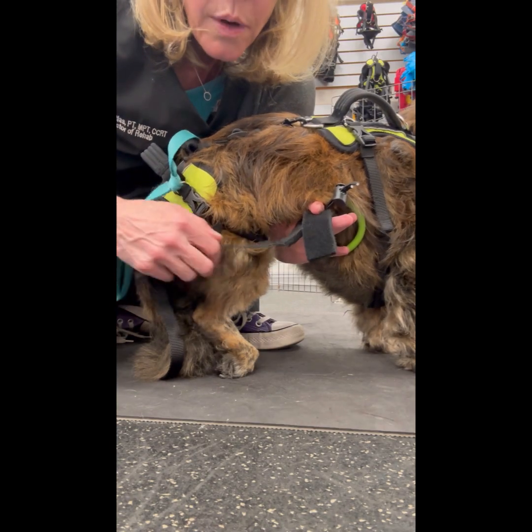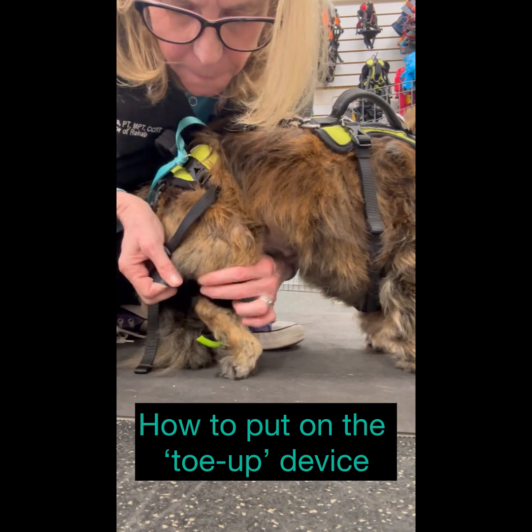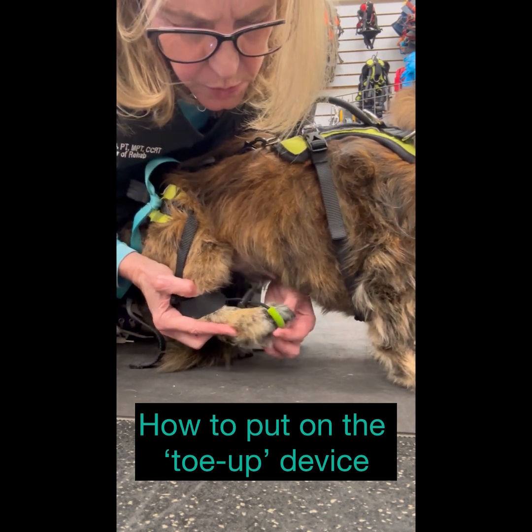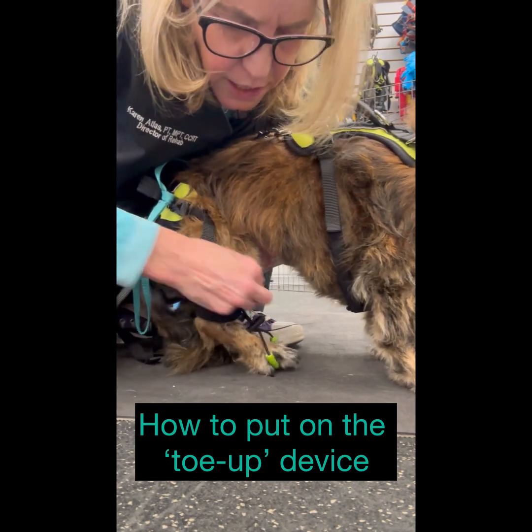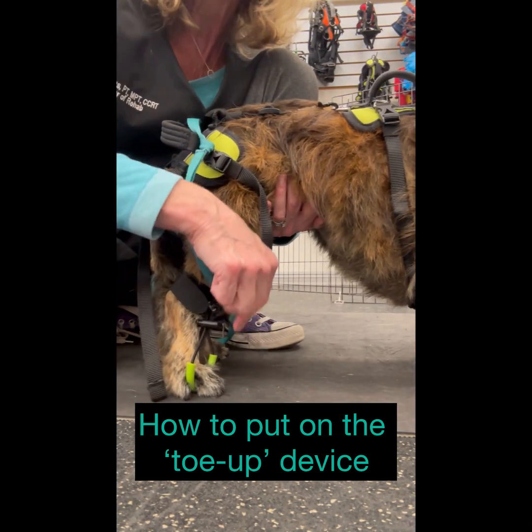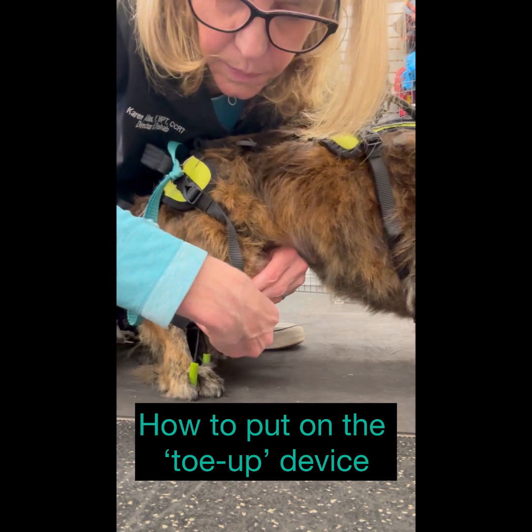Now to put the toe up on, you just put the cuff above the hock joint. Then bring the loop around the middle two toes, and then you can adjust the tension using the cord lock on top.